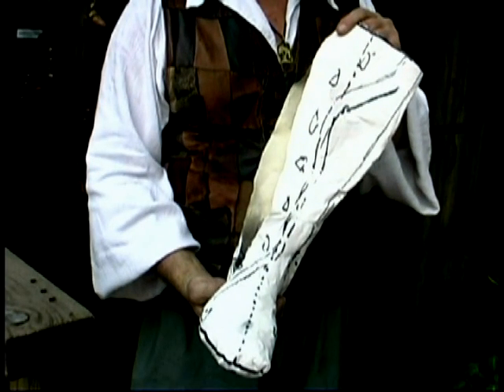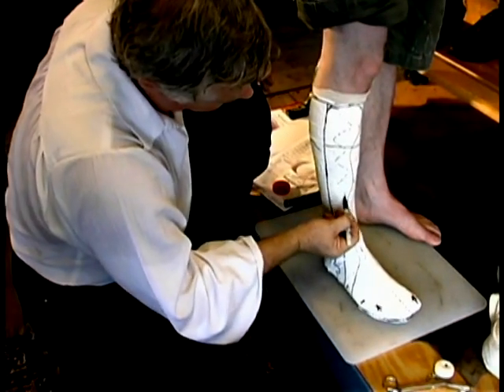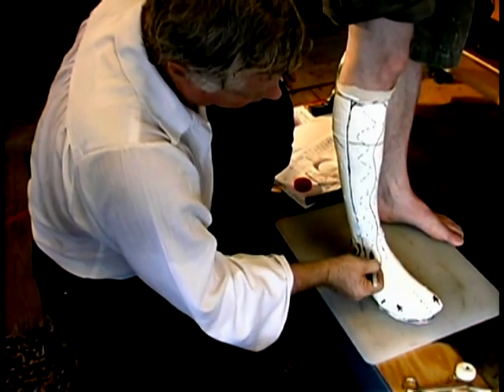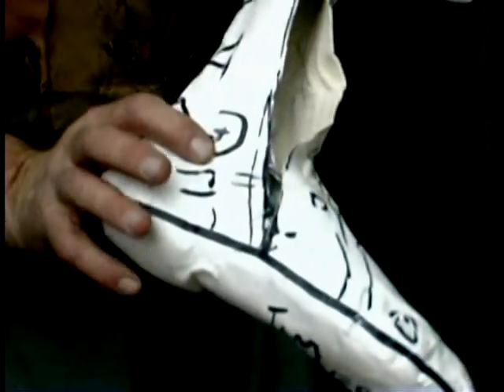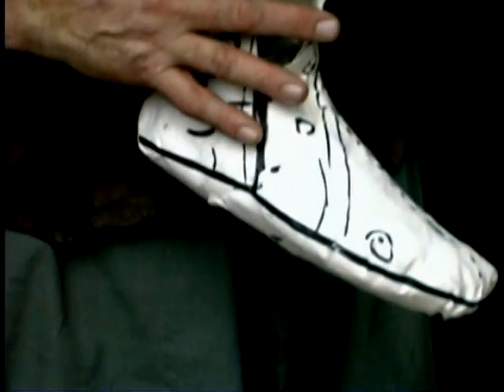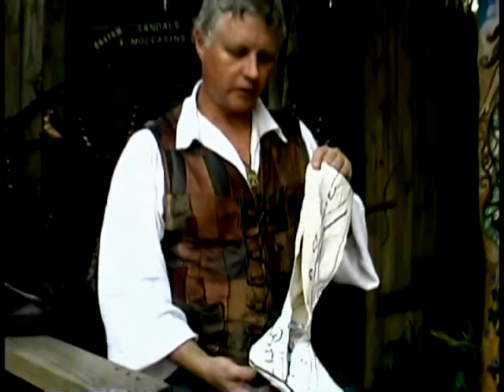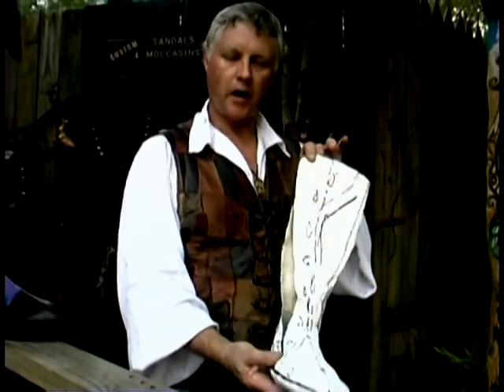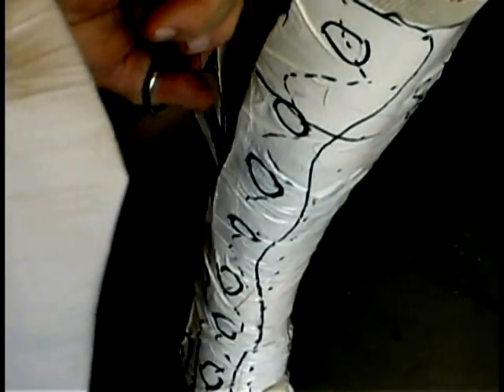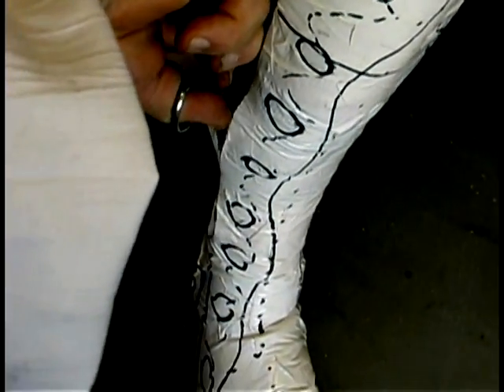Once the casting process is done, we put the design on the boot so that people can see and we have a reference. We mark the inside and outside ball of the foot and the inside and outside ankle bones, so that the boot is structured to fit anatomically over the foot. What we end up with is a cast that we cut apart, flatten, and use as a pattern.